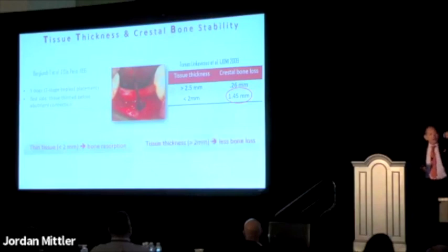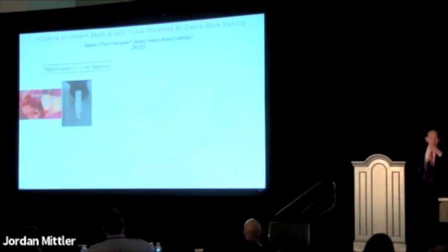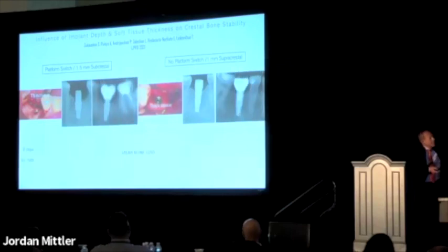So now you've got this connection that's placed inside the bone. So this is a follow-up by this other study. He said, well, if you place it deeper, so he took the implants and he placed these implants deeper inside the bone, in patients that had thin tissue. And he compared this to a control group where the implants were of matching connection, but placed supercrestal, so they're placed outside the bone. And he concluded that when the tissue was thin, even when you place it deep, you still have more bone loss than if the tissue was thick.